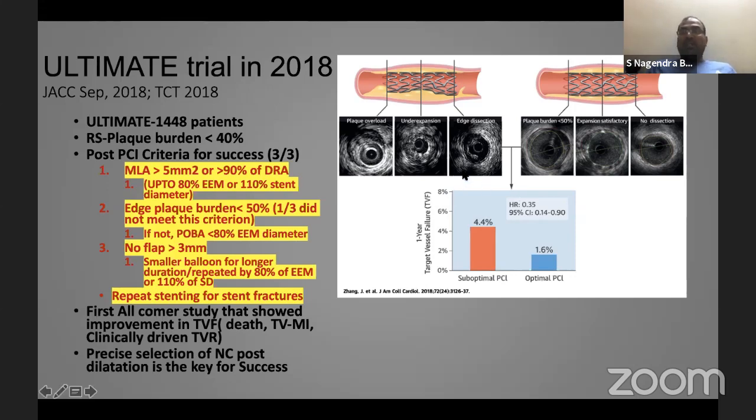There was no difference in death or cardiovascular mortality. Of course, there is no decrease in death or cardiovascular mortality in PCI itself. Having said that, IVUS-guided PCI has been shown to reduce mortality, even cardiovascular mortality and all-cause mortality, in a meta-analysis published way back in 2017. If you isolate the studies with left main alone, it decreases events. But if you go with all-cause mortality, it does not decrease even the clinical hard endpoints, just because we have included all low-risk patients.